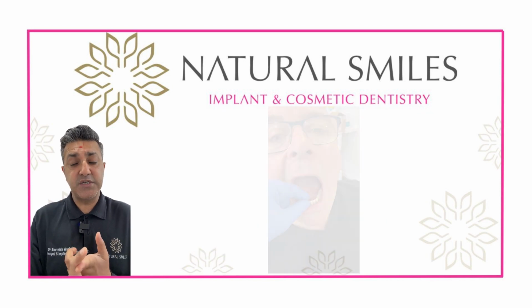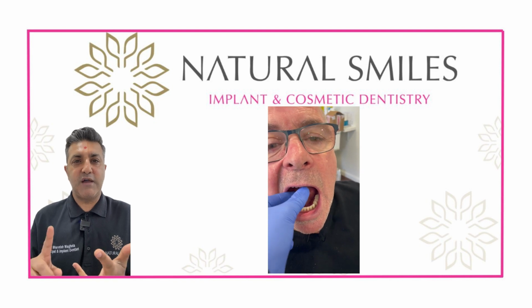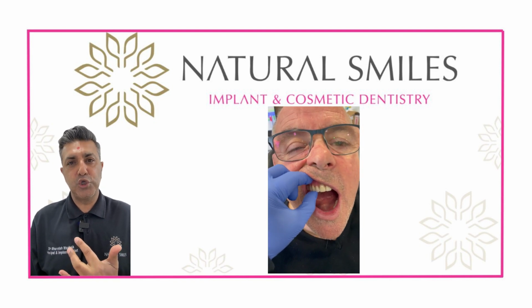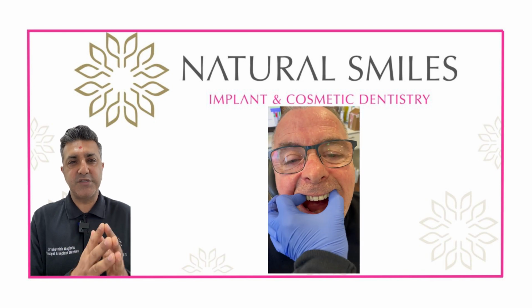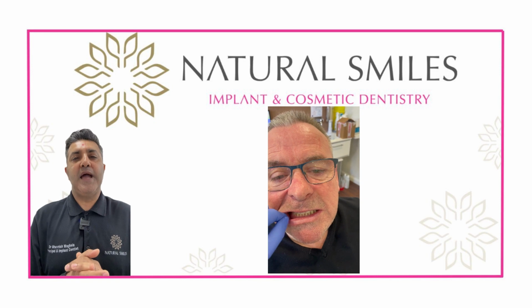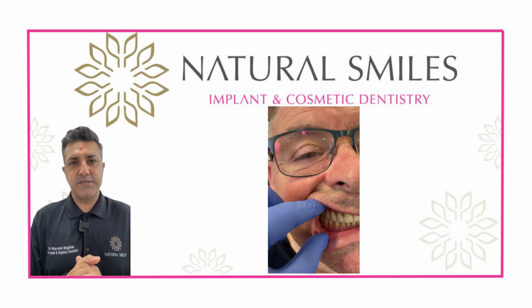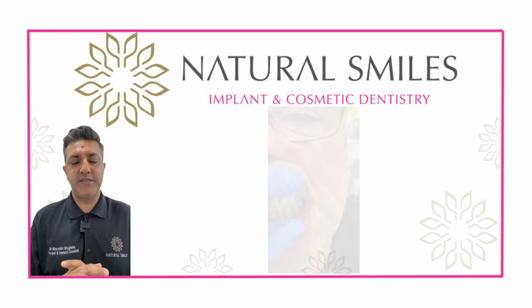So loose dentures, dentures that rub on the gum, dentures that fall out and they have to use glue. So anything where there is a problem with a denture, we can use dental implants under the denture, and those dentures are subsequently retained by the implants.